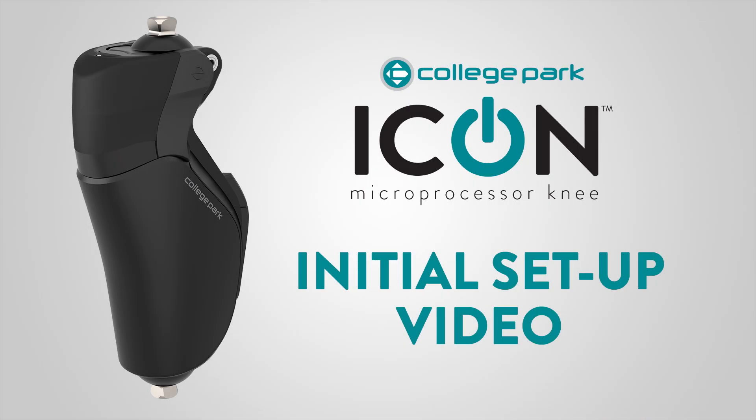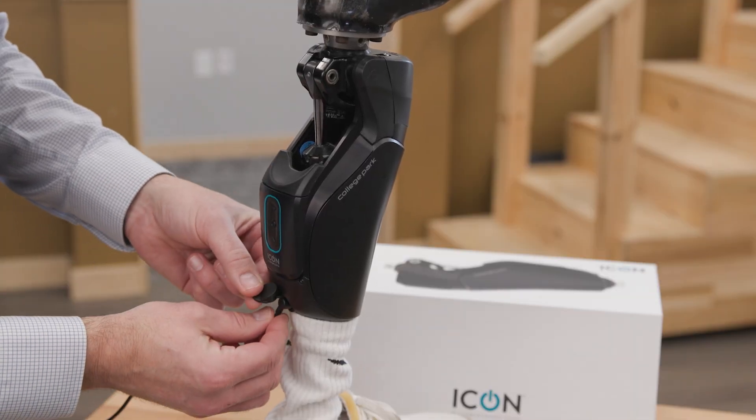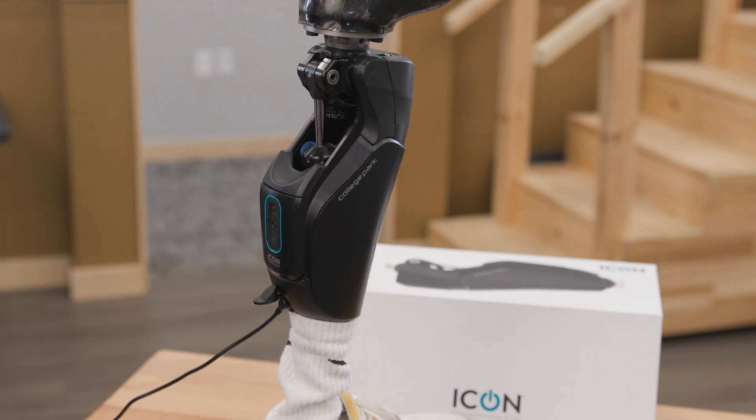Welcome to the training video for the Icon microprocessor knee. Our goal is to make the setup of this knee easy for both you and your patient. We recommend watching this video prior to your patient's first fitting. If you have not charged the knee to 100% yet, do it now.